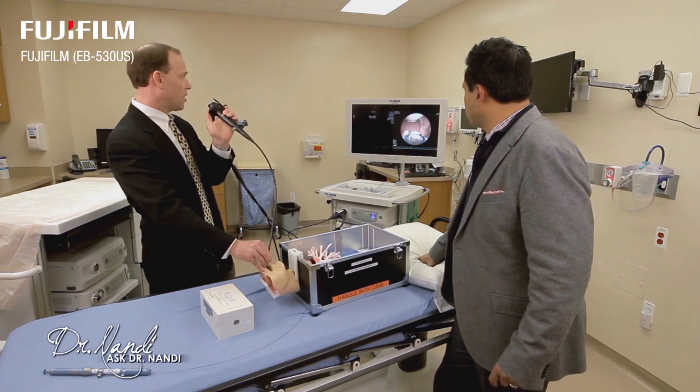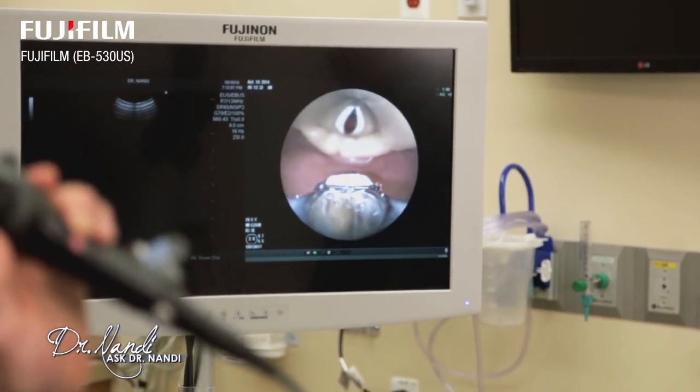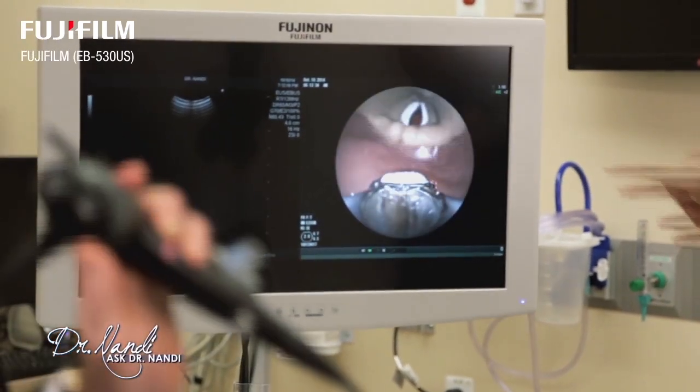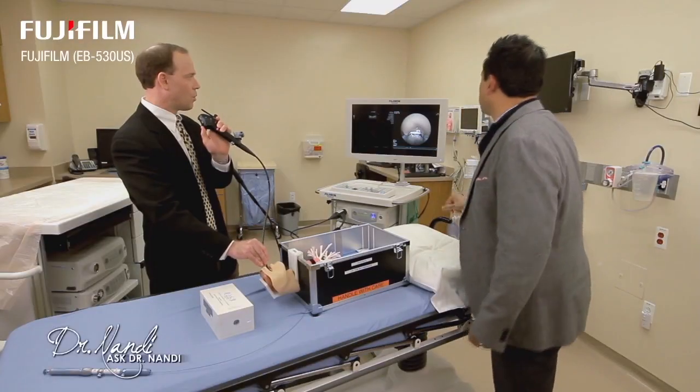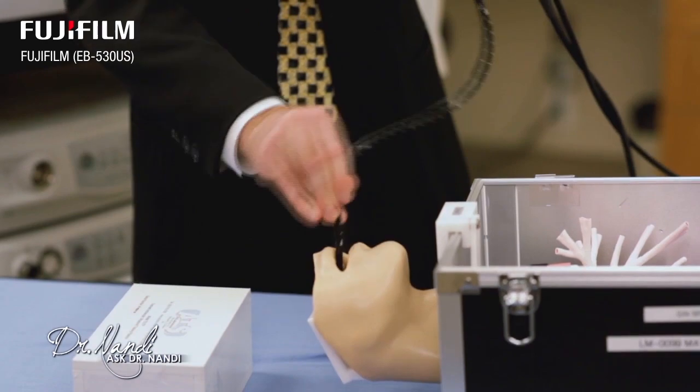Nice. That's the uvula. It's a nice picture. It is a nice picture. And that's the epiglottis, and those white band-like structures are the vocal cords. Right here. Yep, the vocal cords. Right there. So we generally want to get up above them, and then once we get through, it generally goes in easier.